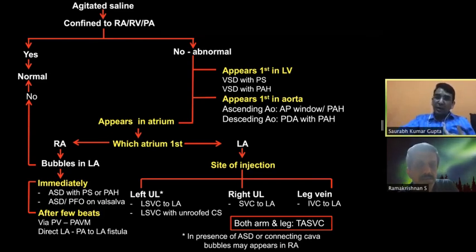Whenever we are doing this for PFO, if your injection is negative and you are seriously considering PFO in such a condition, then always confirm or repeat the injection from a lower limb vein, preferably a proximal vein. Add a provocative maneuver, and if the patient gives any history suggestive of orthodeoxia, then consider making the patient half upright or partly upright. It may be difficult, but then it shows up. TEE, as I've already highlighted, has difficulties, but yes, imaging quality is superior, and we get to see much better images.